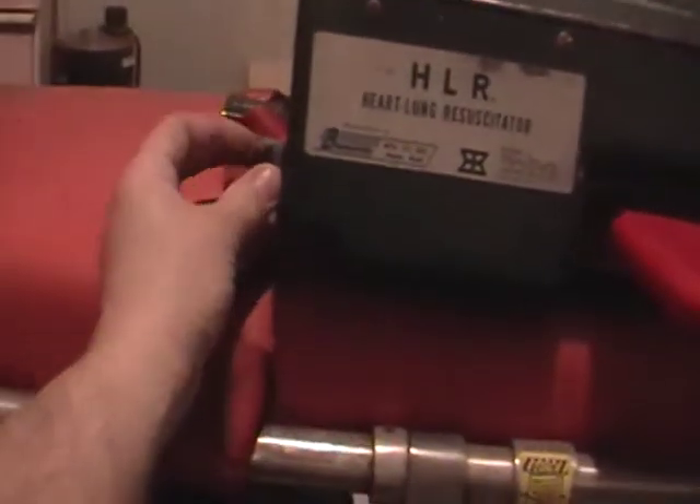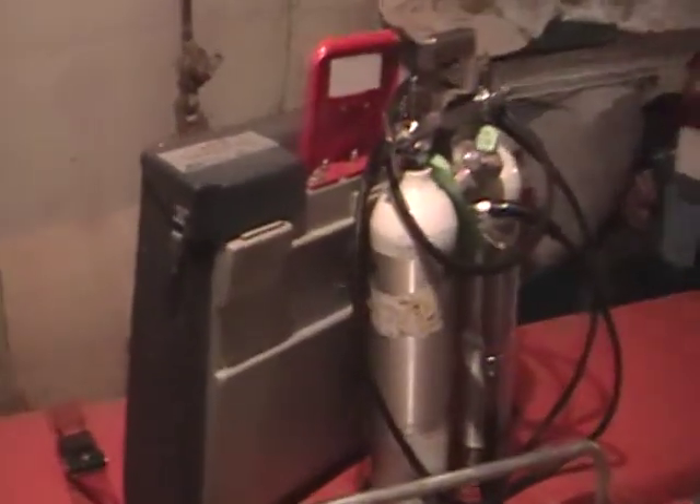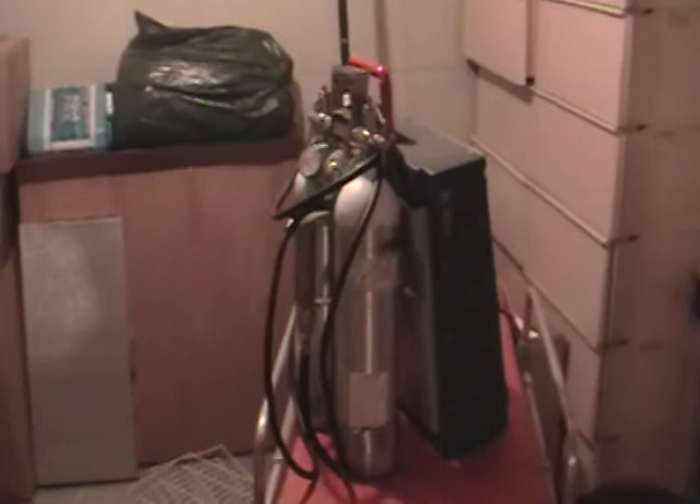Front view of the case — here we are. We are now ready to respond to our next cardiac arrest with our state-of-the-art HLR, Heart Lung Resuscitator.